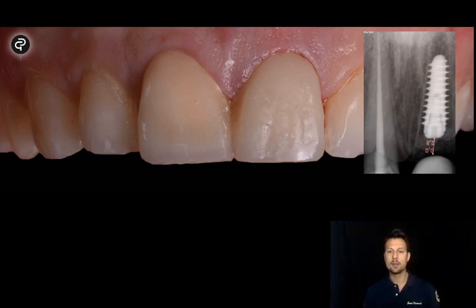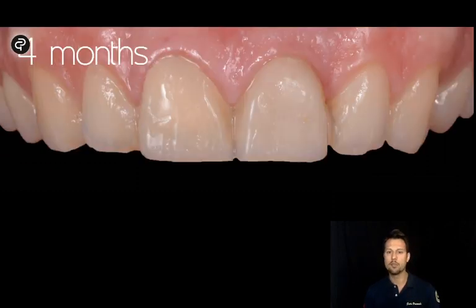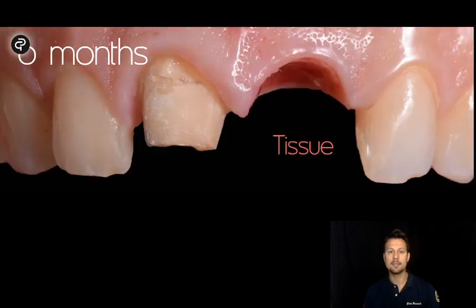And so this is the immediate placement of the Maryland in the mouth. This is the outcome at 4 months, and this is at 6 months. It's very impressive because we are ready to impress it. The architecture is amazing.